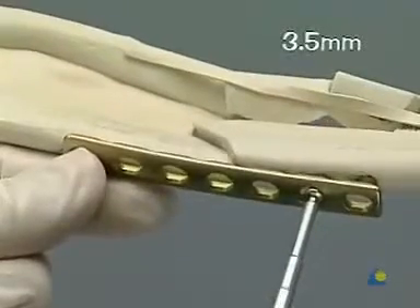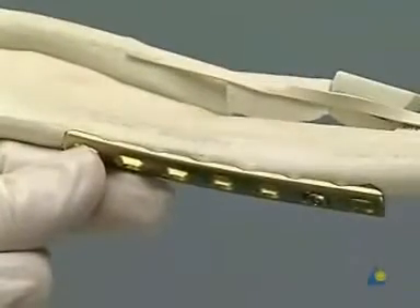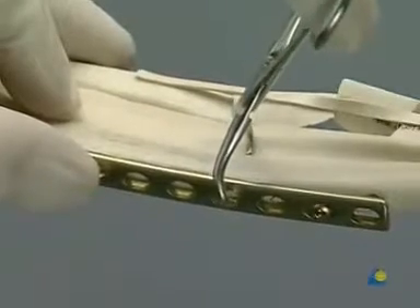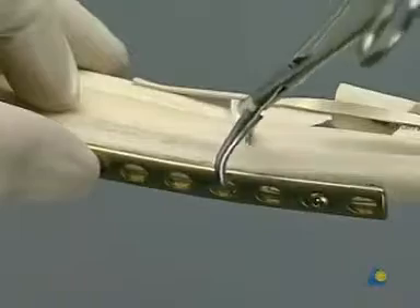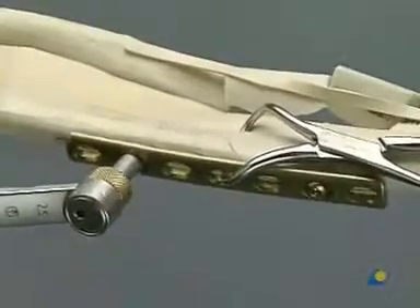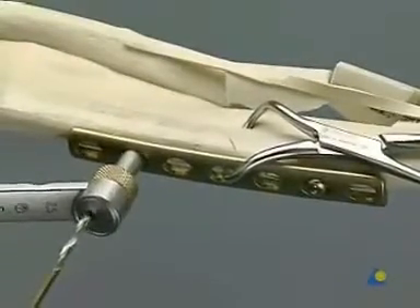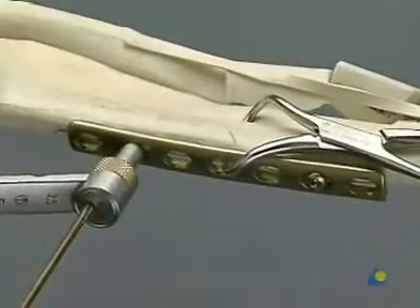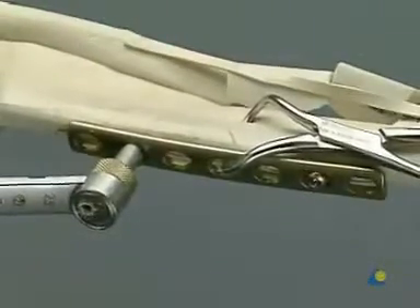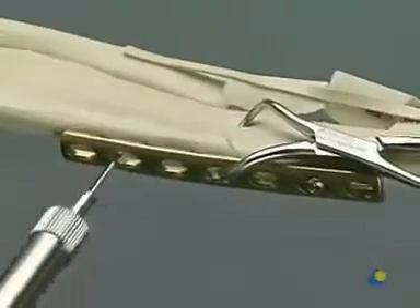As the pre-bent plate is applied, the fracture is reduced again and once more held with the pointed reduction forceps. The first distal screw hole is made using the yellow drill guide to produce an eccentric load position. Measuring, tapping, and insertion follow in the usual manner.